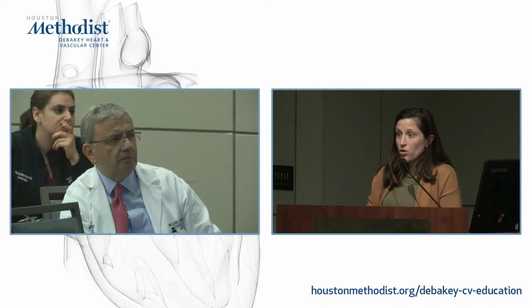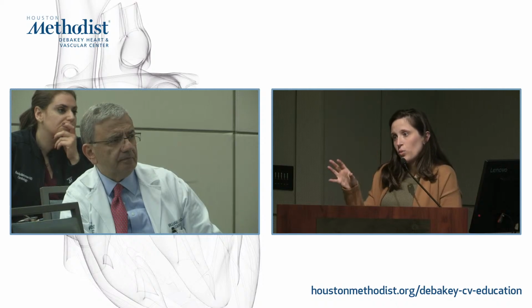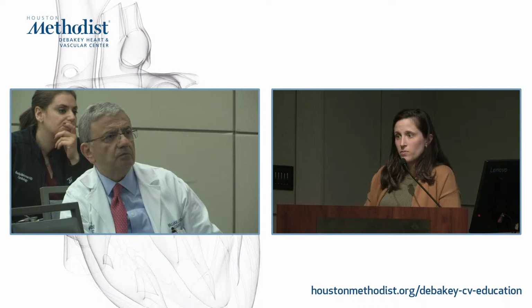I can't speak for other centers, but here we use it on the same console. So we connect the ICE, and the imager drives the capture and the zooming, the color, the angle for the ICE, and the interventionalist will manage the ICE catheter itself to acquire the images.